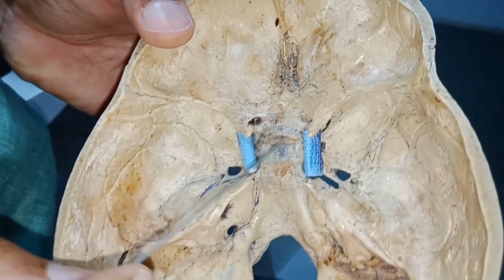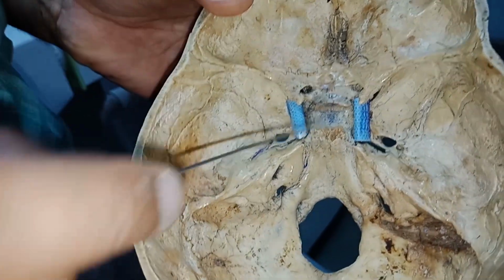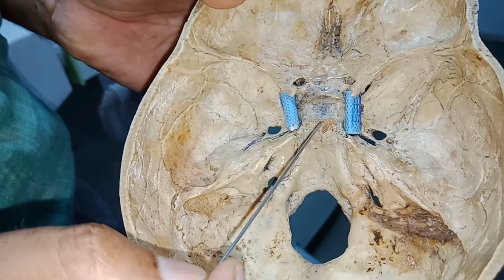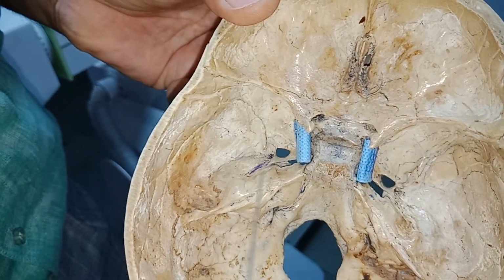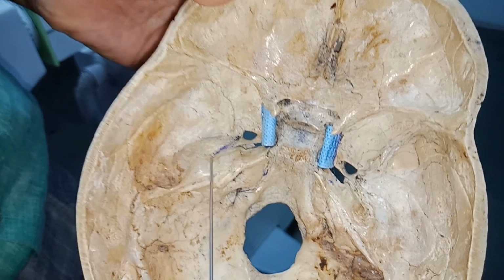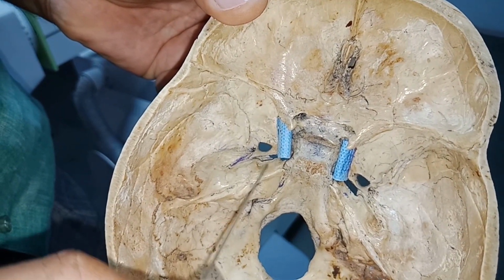Now this is the sella turcica. This is the slope, the clivus, anterior clinoid process. Posterior clinoid process is broken here. So this is the other side, foramen ovale, petrous part of the temporal bone. The anterior slope, if I go medially, this is the place which is called the Meckel's cave.